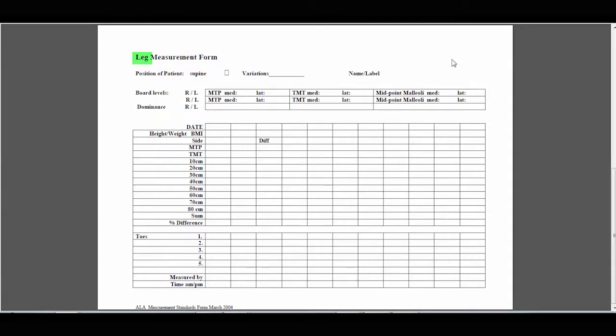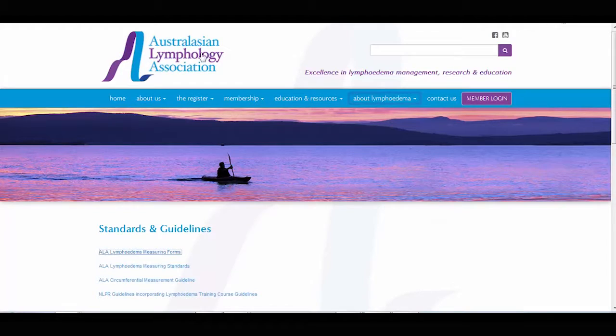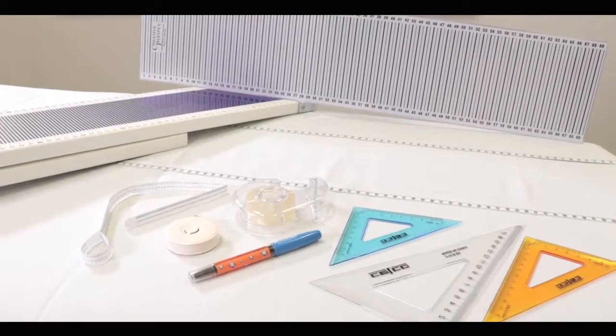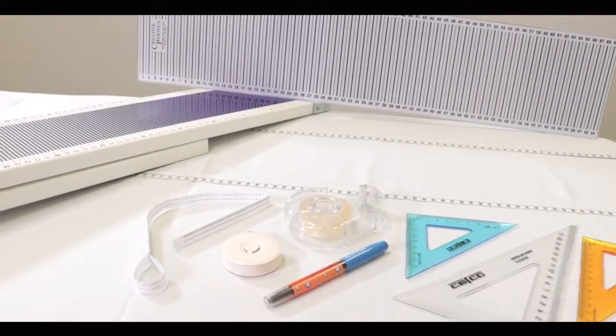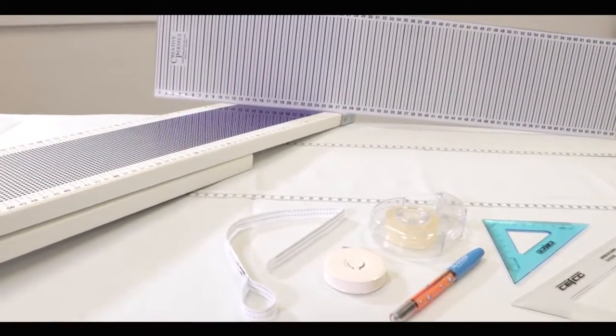The measuring standards outline a consistent way to measure a patient's arm from one visit to the next. To ensure accurate and reproducible marking of the arm, the use of a limb measuring board is recommended.